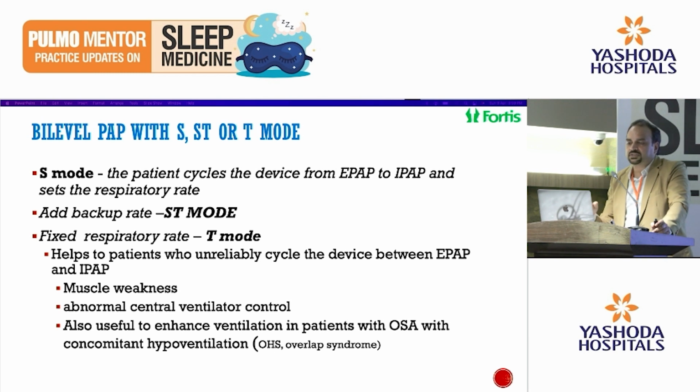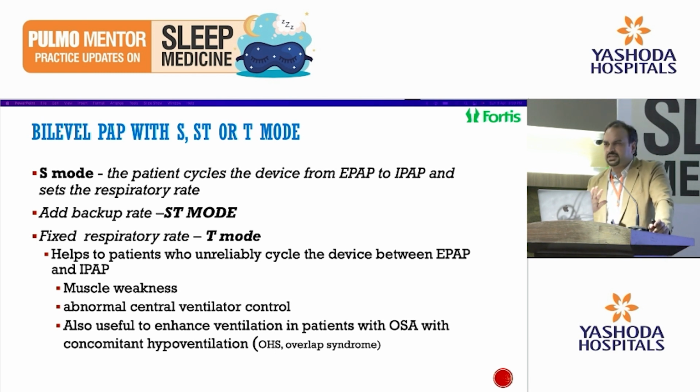Then there are modes, in terms of S mode. S mode is the very simple mode in which the patient is able to cycle his or her breath spontaneously. So this is called spontaneous mode. The patient cycles the device from EPAP to IPAP.